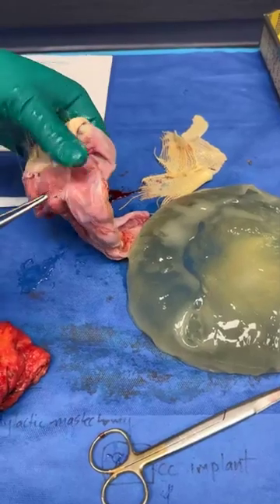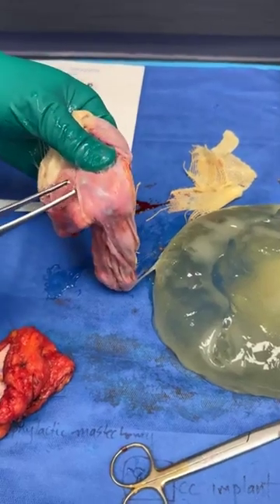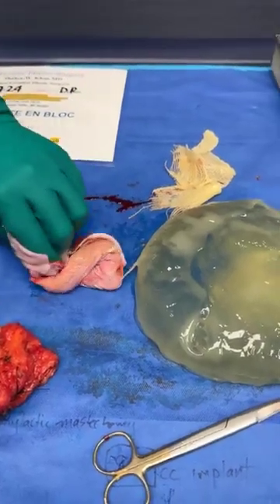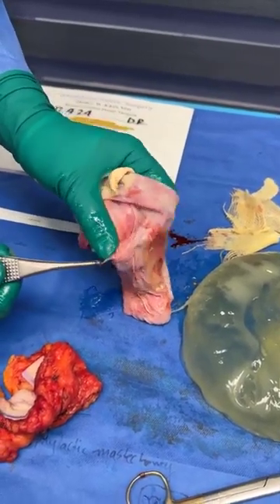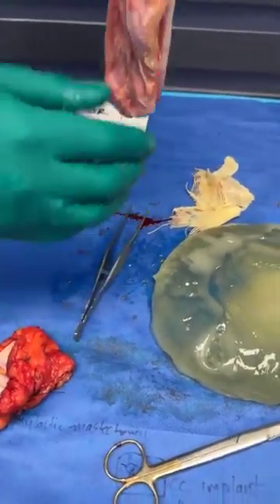You can see right here, right? You can see the hard knots right in the proximity of the implant, and you can imagine it's rubbing against the implant, and it's going to cause it to hurt. And you can see, look at the knot right here. It's very thick, braided Ethibond suture. Let me go ahead and look.